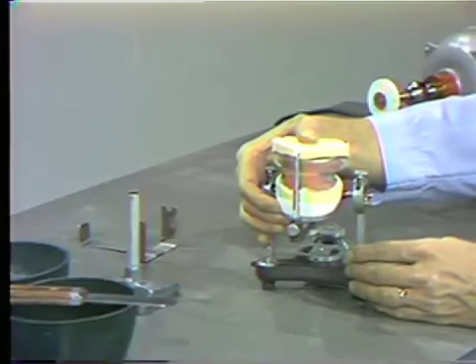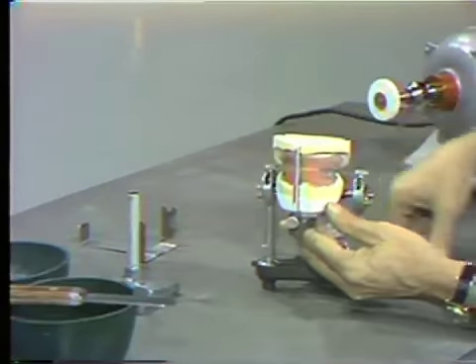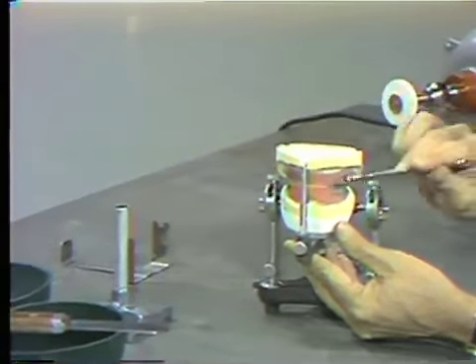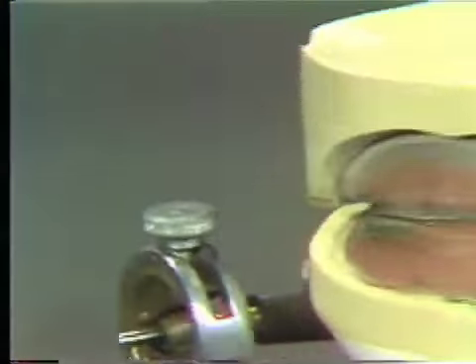We will now lute the 2 casts, or the 2 bases together by luting the wax together. And with the number 7 heated over the Bunsen, we will seal the wax on both sides.